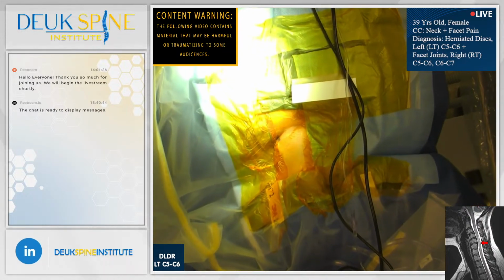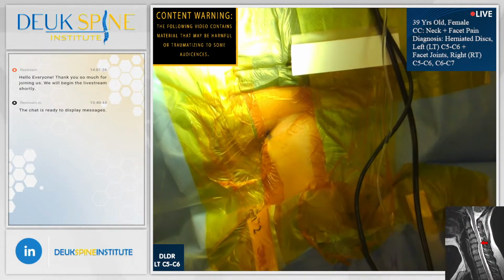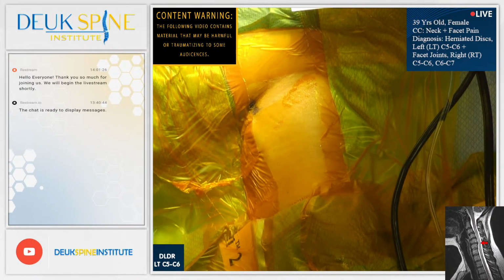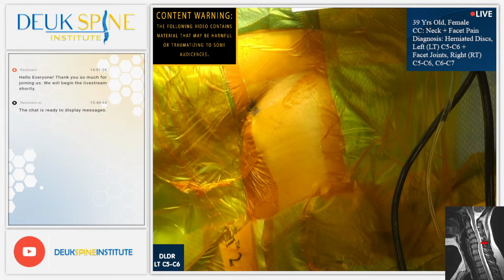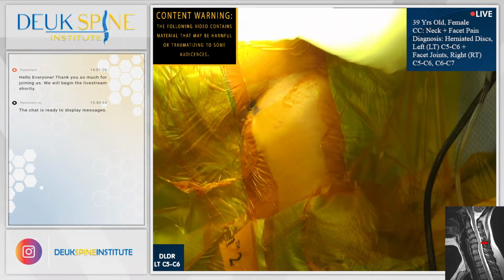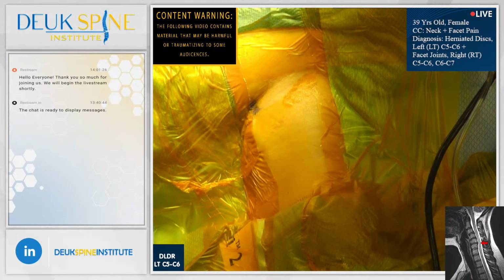We are streaming spine surgery today. Our patient travels to us from Florida. She just had the Deuk plasma rhizotomy done for facet joint pain. If you look at the YouTube channel, you'll see we did a right C5-C6 Deuk plasma rhizotomy to destroy pain nerves that were very overactive in her neck on the right side. And we've treated her facet joint pain. Now we're going to go in and fix the herniated disc at C5-6.